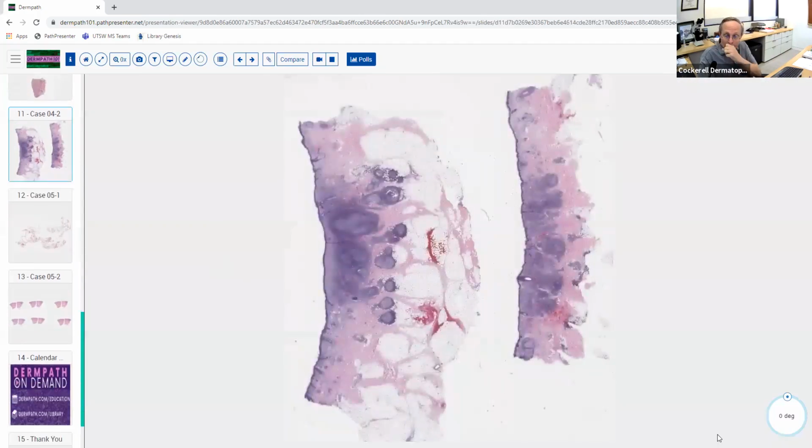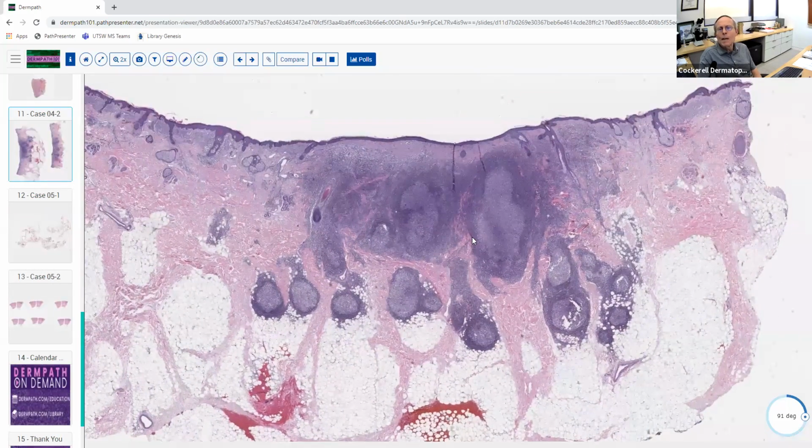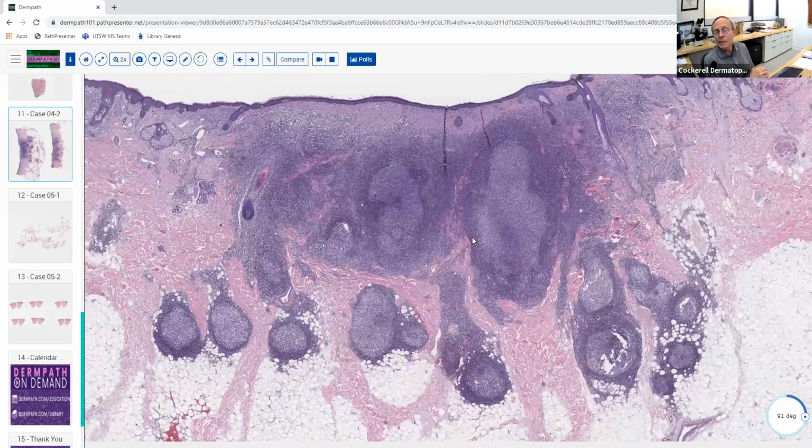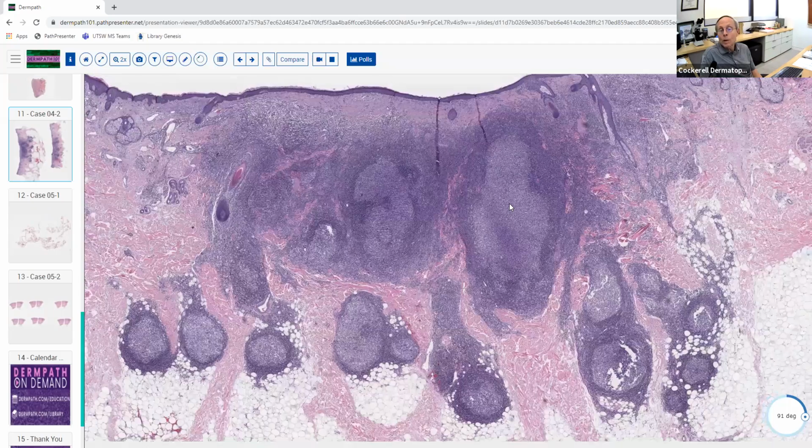Now this is a lymphoma. Generally a little different pattern when lymphoma spreads to the skin. I think this was somebody that may have had follicle center cell lymphoma that spread to the skin secondarily. It doesn't tend to give you that interstitial pattern like leukemia does. It looks different, or cannonball type metastasis. And it actually looks a lot like primary lymphoma also. It's sometimes difficult to tell. So this is follicle center cell. You could probably recognize it right away.